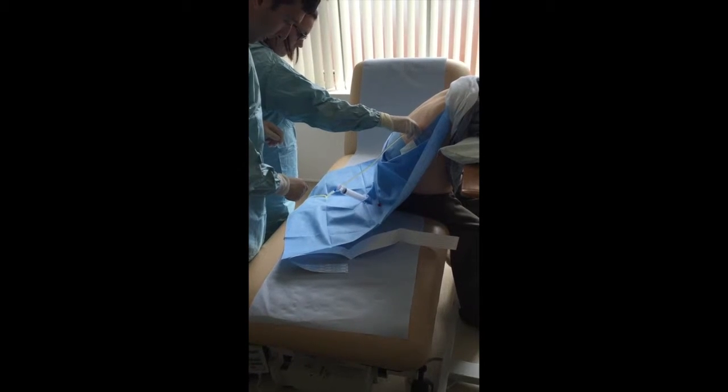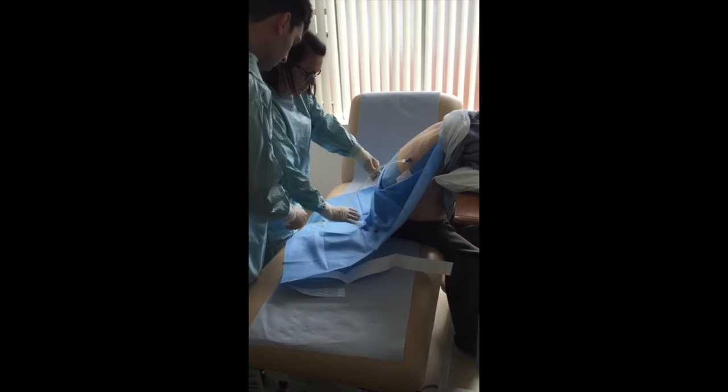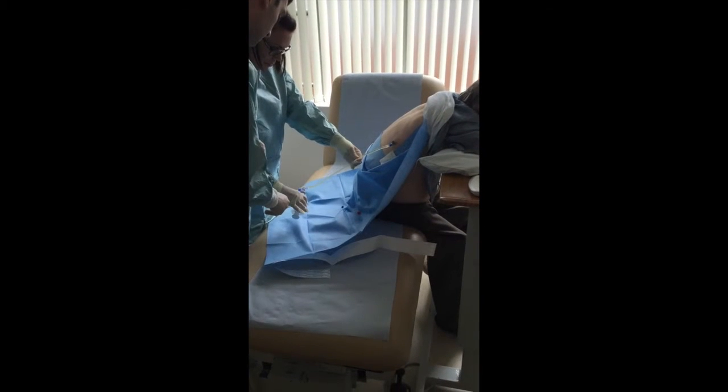And that'll just flow into the bag by gravity. If you have a really viscous effusion, or if you've got somebody that's got quite a weak cough, then what you might have to do is aspirate with this, and I'll just show you how to do that.